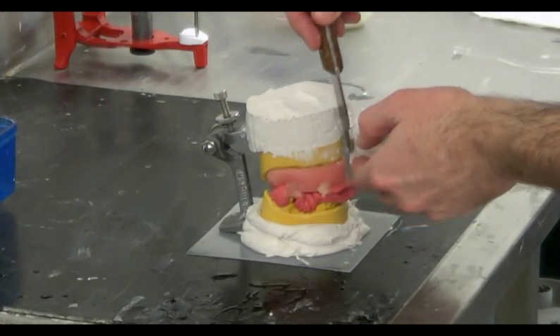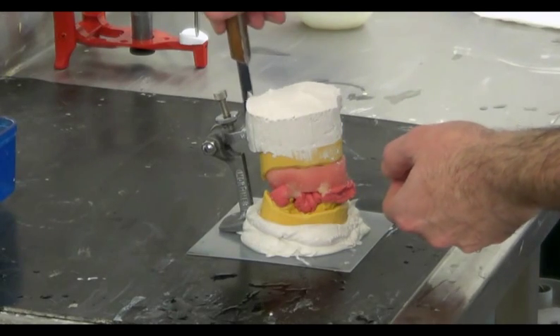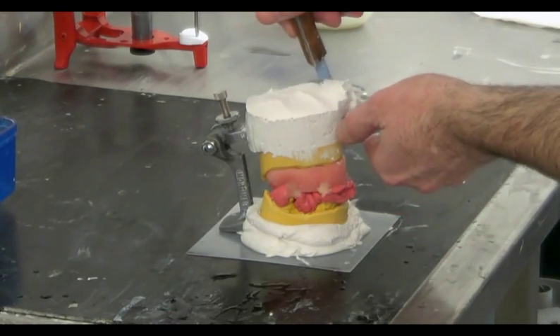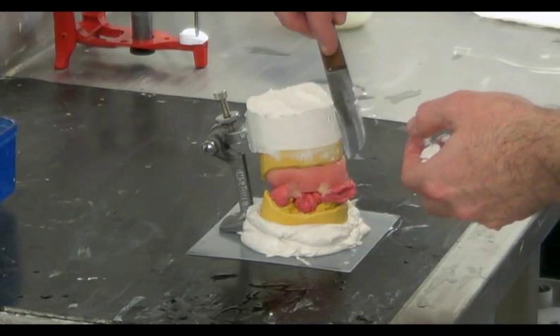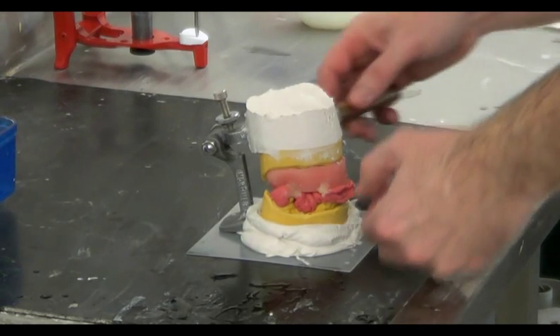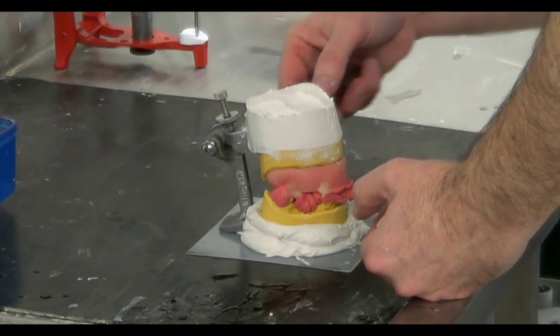We can use a spatula to smooth the plaster, attempting to leave the top and base horizontal and therefore level with the occlusal table. The side walls should be smoothed until they're parallel with the side walls of the model.